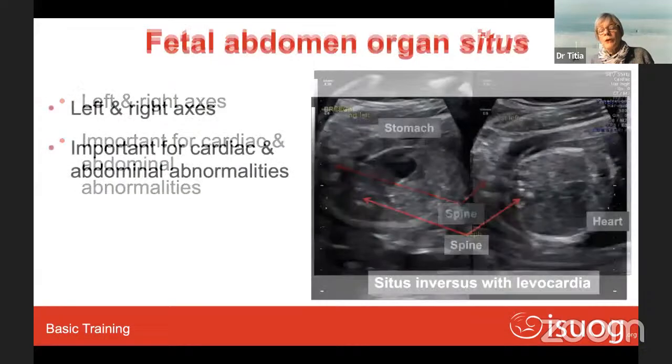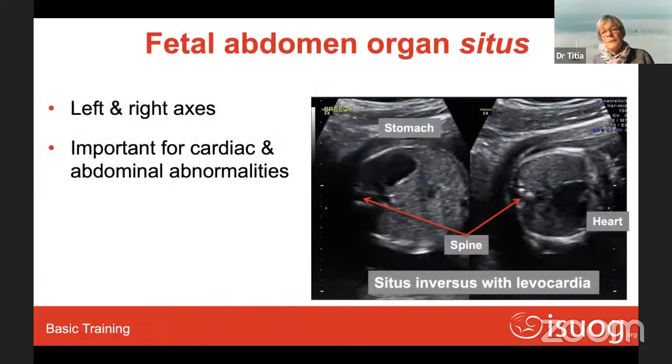Now, it depends where the back of the baby is, obviously. In this case, we know we are looking at a breech position. We had determined that at the start of the scan. And when you are in a breech position, and again, the back on the right side of the mother, I could do the same thing. I could move myself being in a breech, the right side of the mother.